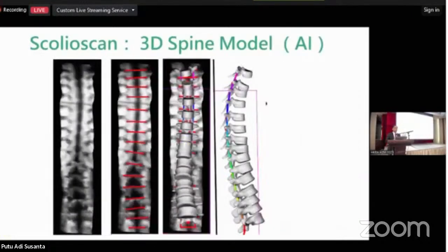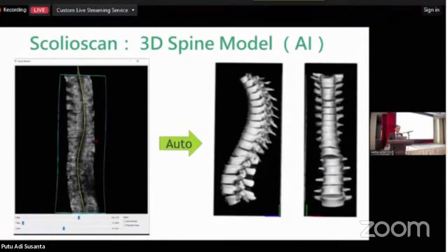So one thing we are working on is modeling, for the 3D model. But remember, there's one part ultrasound cannot see, that is the dark region, the vertebral body. Because the ultrasound is from the back, we cannot see the vertebral body. But unfortunately, for most of the scoliosis subjects, they at least have one X-ray. Once they confirm their scoliosis, they will have one X-ray. So that X-ray can be used to fuse into our 3D modeling.